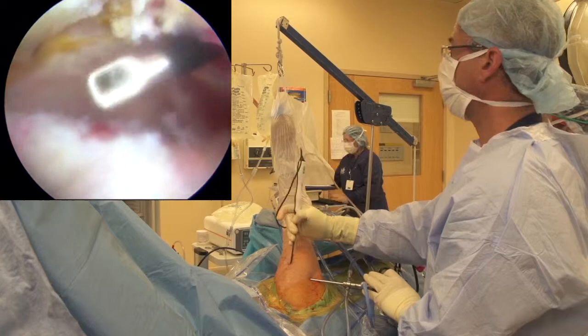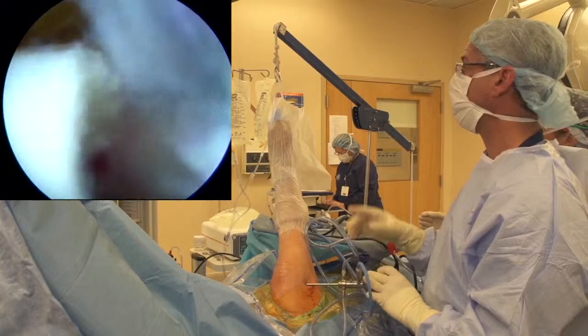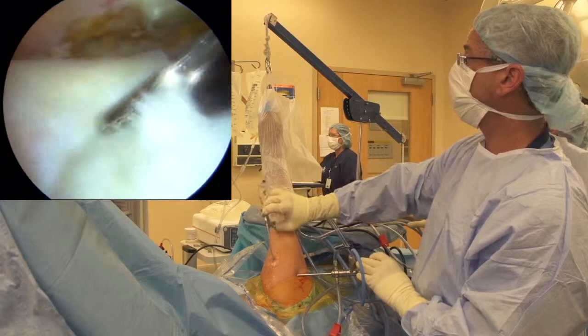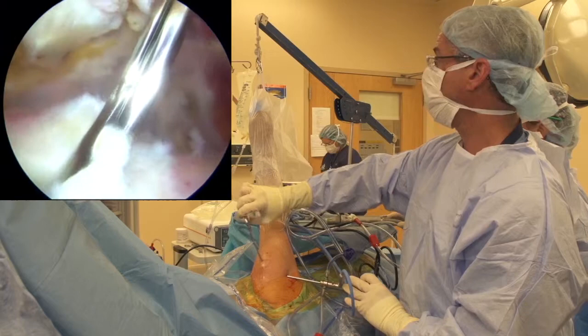What I like to do for all of these rotator cuffs is really get a feel for what they're doing. The beauty about rotator cuff surgery is each one is just a little different. You want to establish the tear pattern so that you're not putting any kind of a repair under tension. This one has a fairly decent appearance as far as its ability to come laterally. I think we have fairly robust tissue now that I've removed the diseased tissue from below. A little bit of a leaflet tear and a split in the infraspinatus interval, but that's going to come over beautifully and lay down onto the footprint under zero tension.